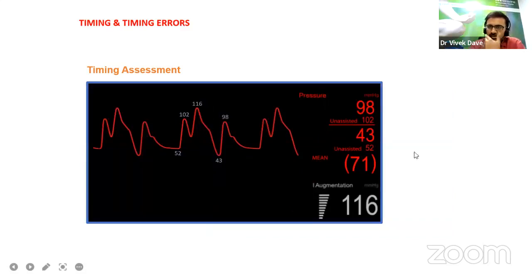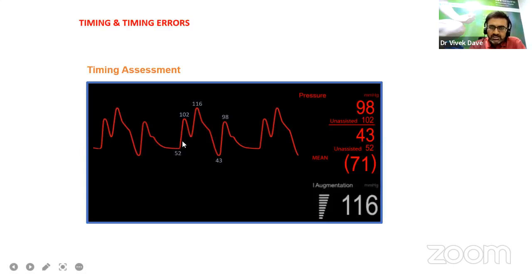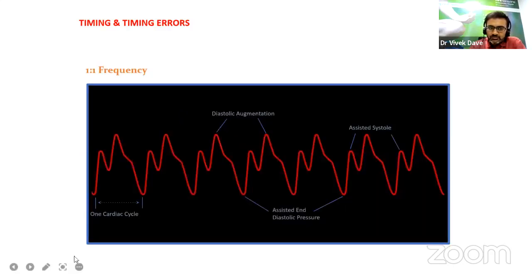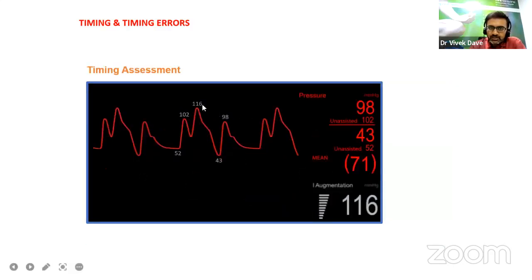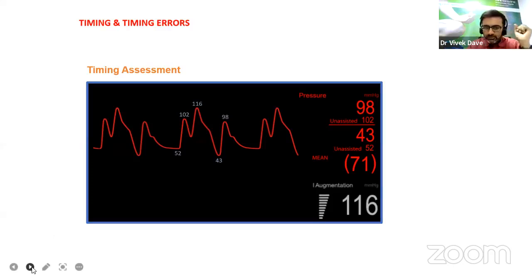This is what you can see on the screen of the IABP machine: systolic blood pressure, diastolic blood pressure, mean arterial pressure, and augmented blood pressure. Previously, unassisted diastolic and unassisted systolic — 102 is unassisted systolic — and this is the augmented blood pressure, along with the assisted diastolic and systolic.